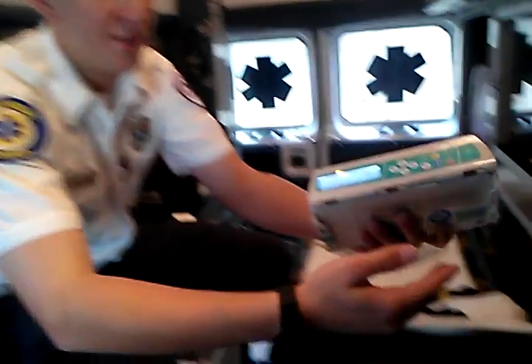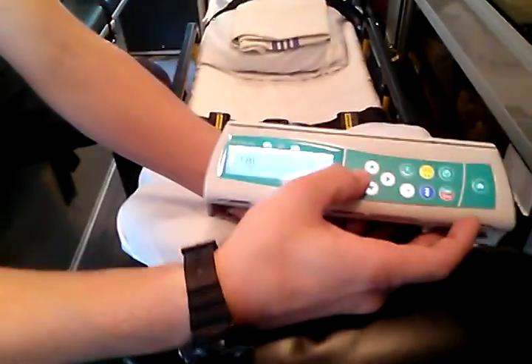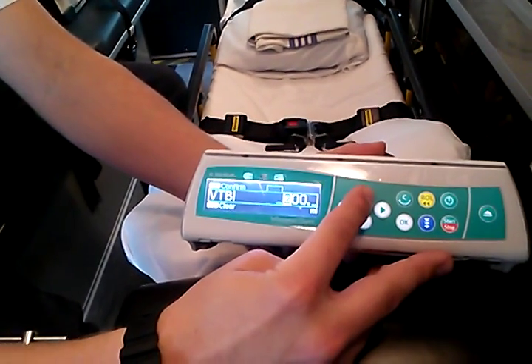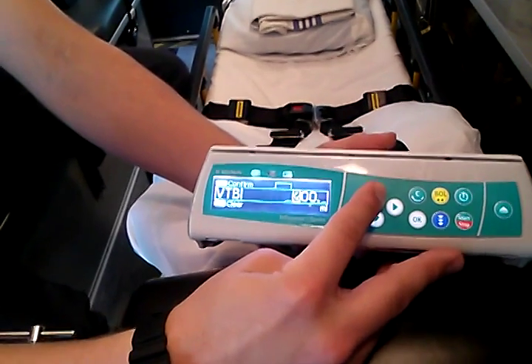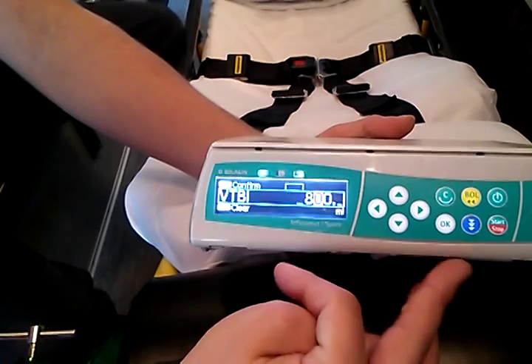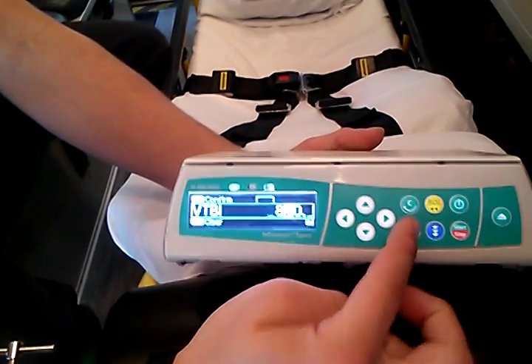Let's say we're going to do a VTBI of 800. Scroll over to the hundreds place and use the arrow key to go up to 800. You can adjust to any number you want — maybe 810 or whatever it is. Once you have your VTBI, just hit OK.